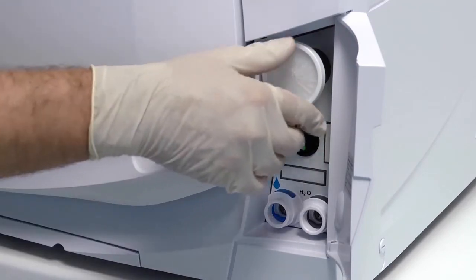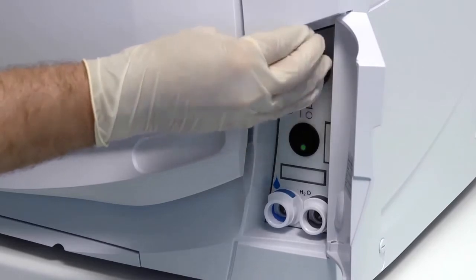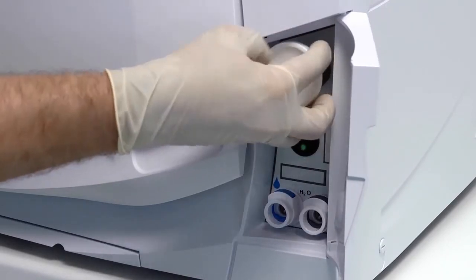To change your filter, unscrew the filter in a counterclockwise direction until it can be fully removed. The old filter can now be disposed of in a domestic waste container.